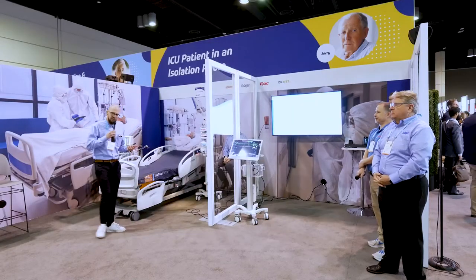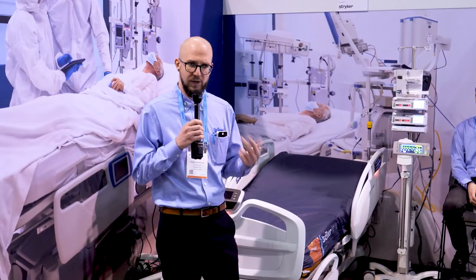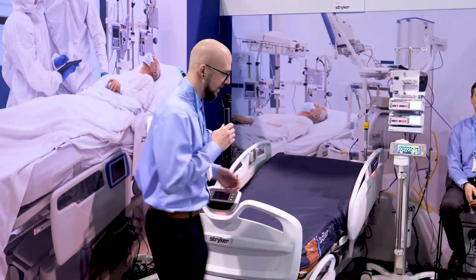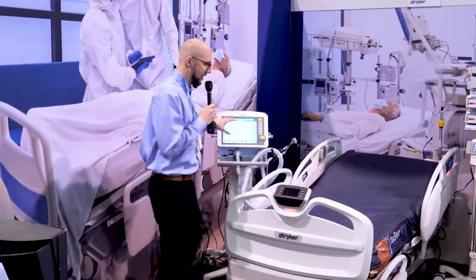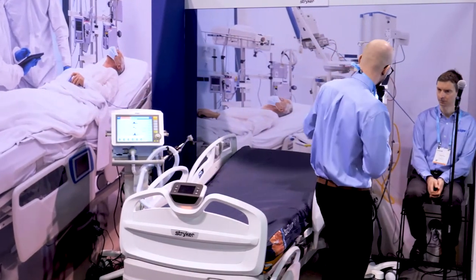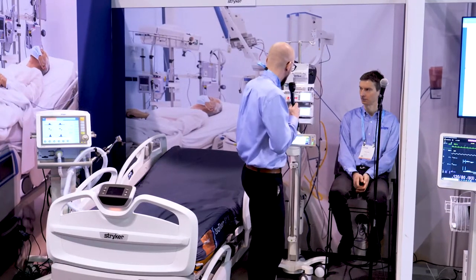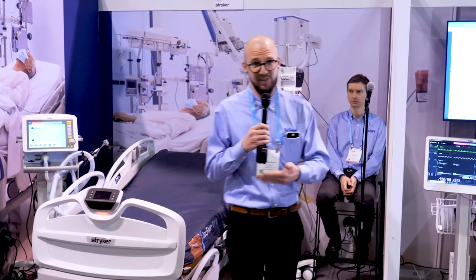Now it's time for the first visitation of the day. The caretaker of Jerry — the physician, occupational and respiratory therapist — are all inside the room checking on Jerry and setting up the ventilator to start the first NIV trial of the day. They set it up to the needs of Jerry's current situation, change some alarm limits on the M540 patient monitor, and change the flow rate of the medication to ensure he's pain-free but not deeply sedated.